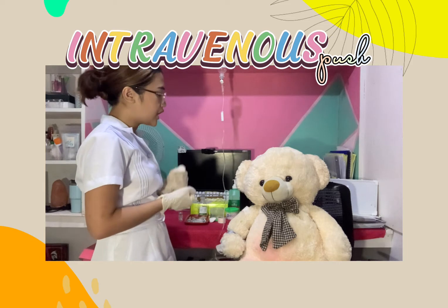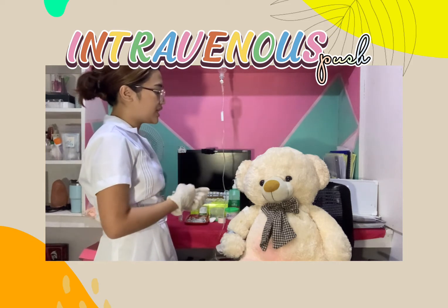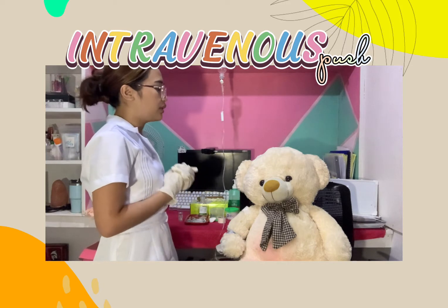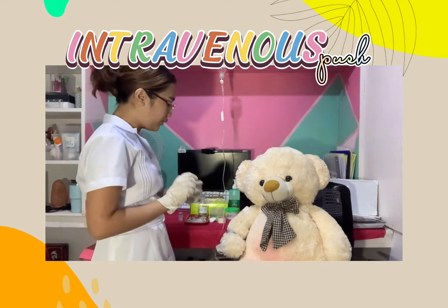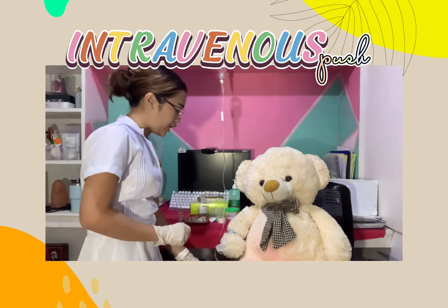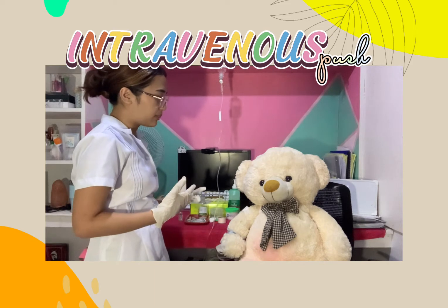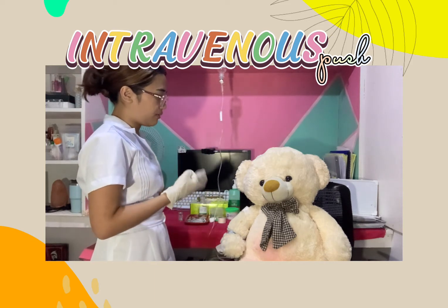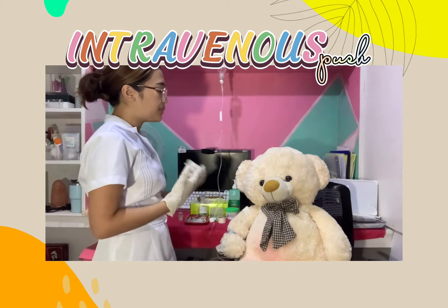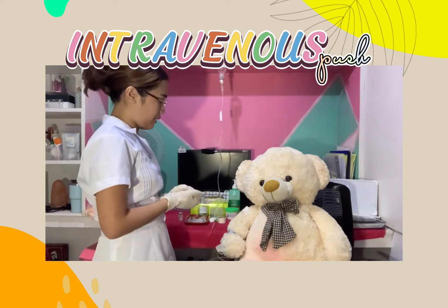Here po, we aim po for you to achieve the immediate and the maximum effect of the medication. We will just inject the medication into the IV port po. You may feel a little discomfort po when the medication is already running through your veins po. Tell us po when there is any discomfort that you feel po that you can't handle anymore po.